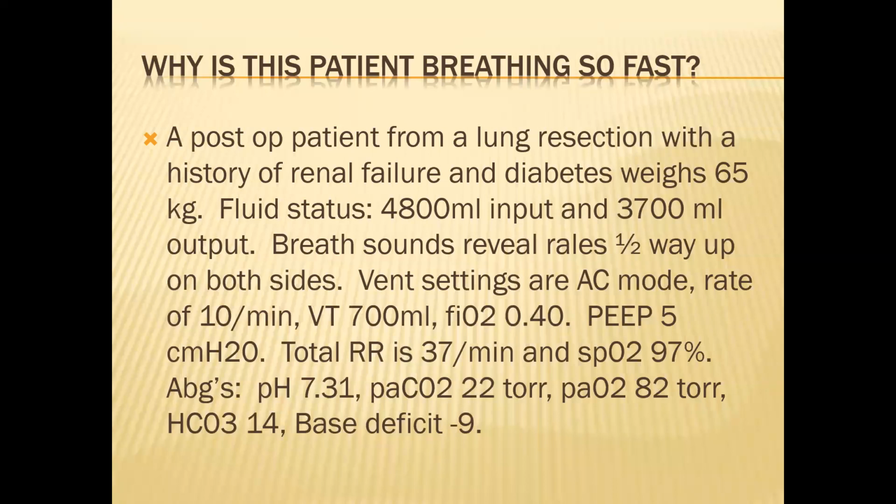Okay, assist control, 10, 700, 40%, 5 of PEEP. Respiratory rate is 37 per minute. Saturation 97%. And now we see the blood gas. pH is 7.31, CO2 is 22, PaO2 is good.